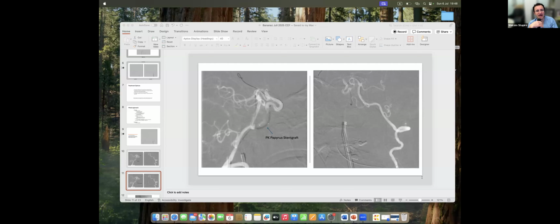In our experience, the sizing is not to oversize it initially, because that means you have to over-dilate it more. But if you size it right, quote unquote, to what the diameter is, then you can dilate it a little bit more after that. And it may not be too much. But like with anything, obviously we have to be careful, and I don't think anyone has a lot of experience with these. Any other comments about sizing, dilatation, deployment? Anyone have experience with that to share?